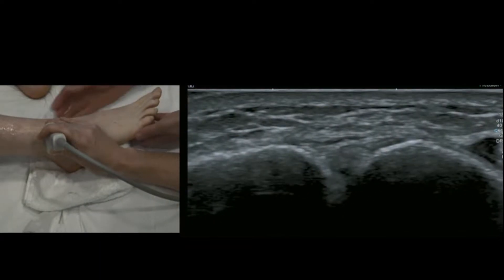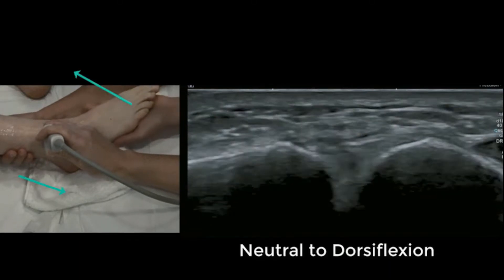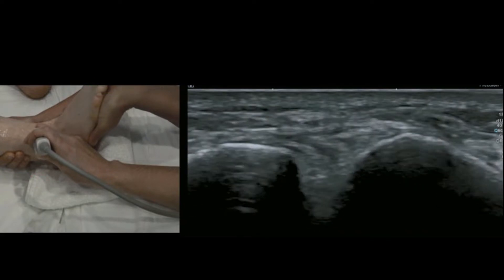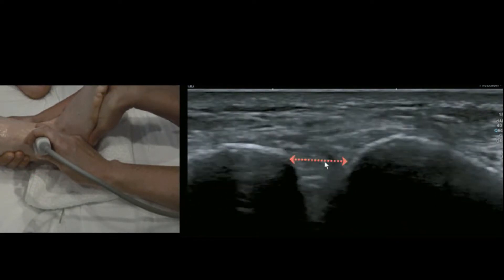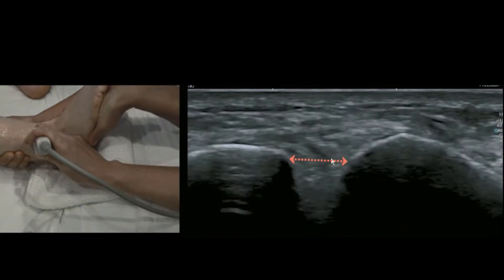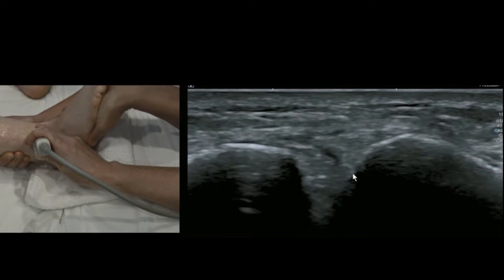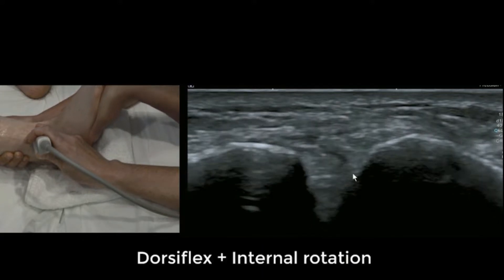We're going to dorsiflex the foot. We ask the patient to ram their heel into the bed at the same time to stabilise the heel. I'm going to wobble around — that's normal. I'm going to choose that little artery there as my visual landmark to try and stay in the same place. You could mark the skin if that's more reliable.